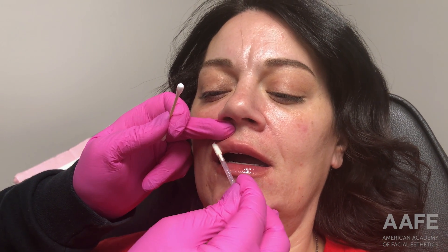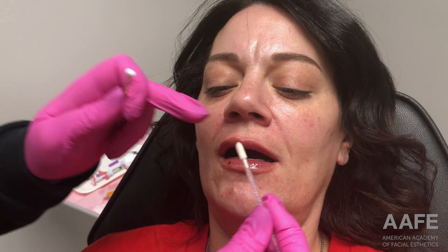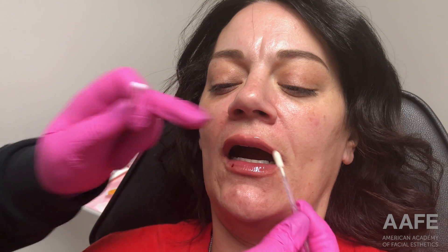That's what I did with her — massaged, made everything look good, which it did — and now I'm going in with the comfort talk lip kit, which is amazing for patients. It's very pretty, helps limit bruising and swelling, and we give one to every single patient that comes in and gets their lips done. That is it for this procedure — thank you so much for watching, and come get trained and certified by the AAFE as soon as you can.